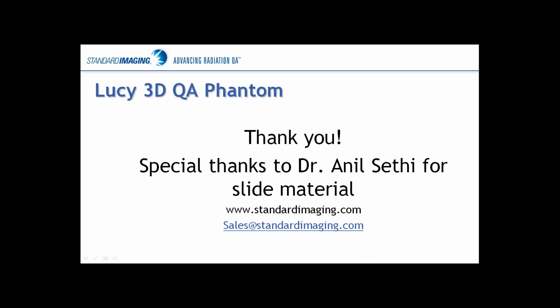There's another question: are there any film inserts at all? Yes, we have a variety of different film inserts. A single film insert, I think it was shown in the presentation, has a single milled out region where you can put a central 4 centimeter by 4 centimeter piece of film. But we also do have a stacked film insert, so you can stack up to 14 pieces of film, each with spacers and markers on those spacers to get your orientation information within that stack of film.